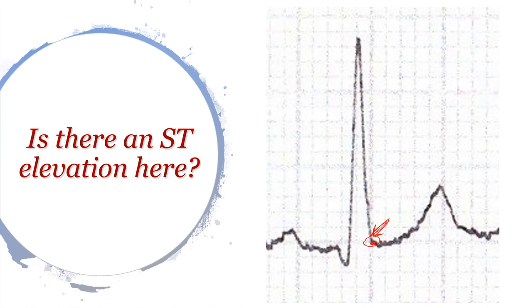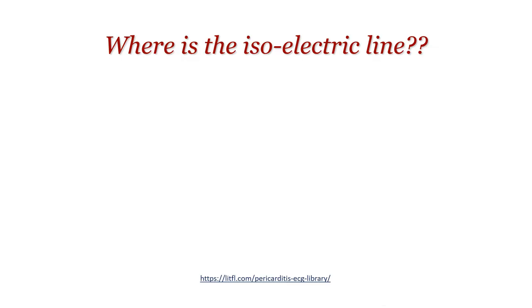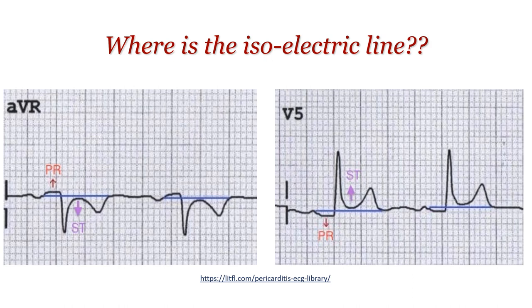It's all about where the baseline is. This is a very common mistake that I personally used to make — and when I learned about it, it changed my whole way of looking at ECGs. I used to use the PR segment as my baseline, comparing the J point to the PR segment. This is wrong, because the PR segment is a dynamic segment — it can go up and it can go down — and it doesn't make sense to compare two dynamic points.